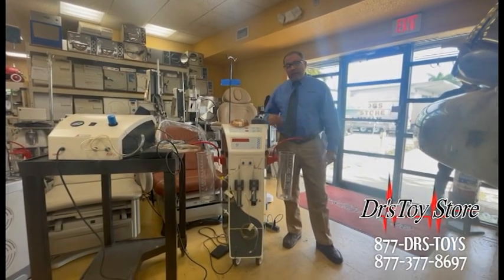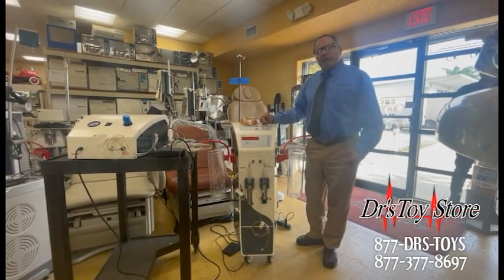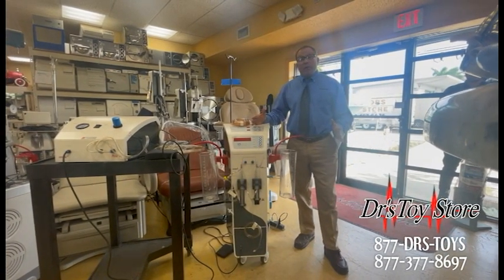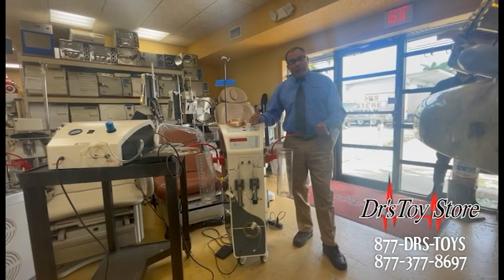Rob with the Doctor's Toy Store, and today I've got the Uromi Lipo, also known as the Tickle Lipo. One thing I've noticed: it is by far the most powerful PAL there is. It's a power-assisted lipo.